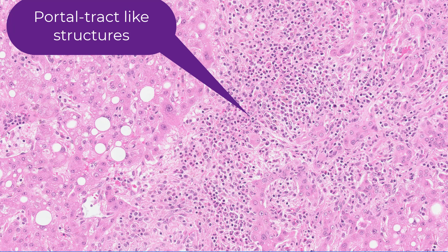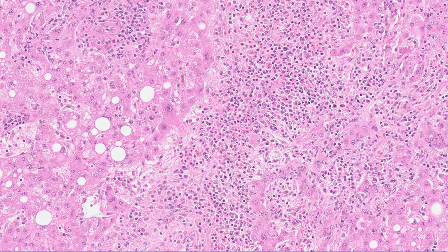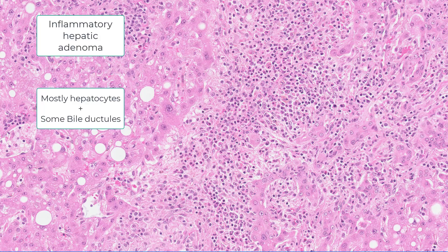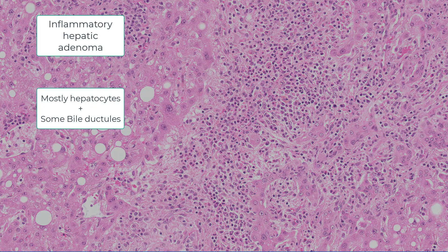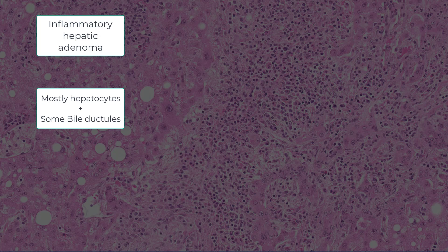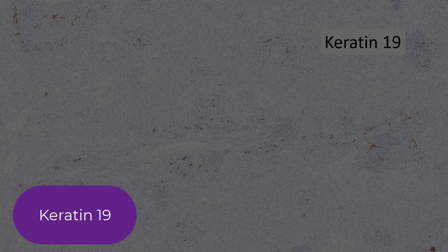This is one exception to the rule that hepatic adenomas are a pure population of hepatocytes. The exception is that inflammatory type adenomas, in addition to hepatocytes, also often show these bile ductules. And if you don't believe me, these are indeed bile ductules, as you can see from this keratin-19 stain.